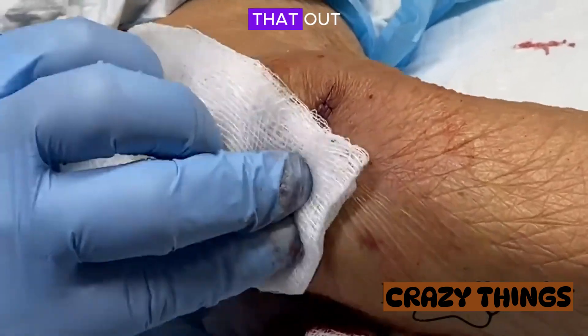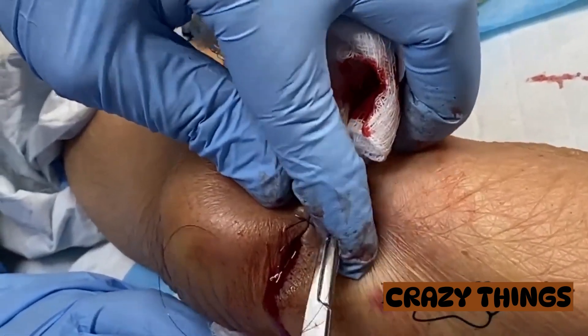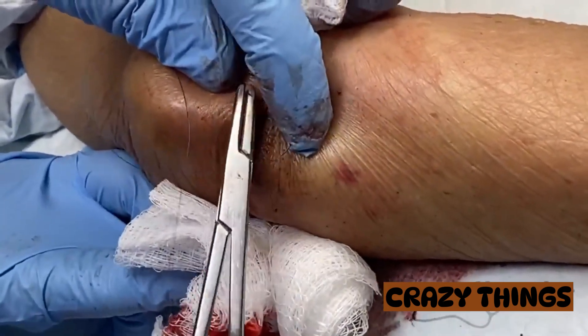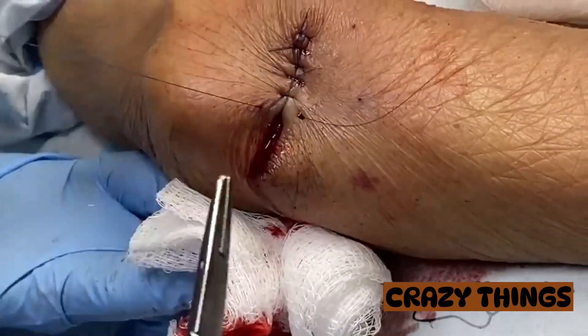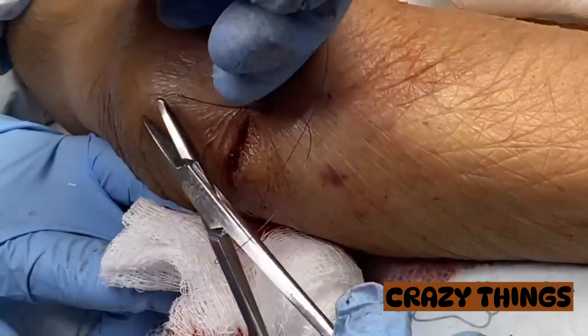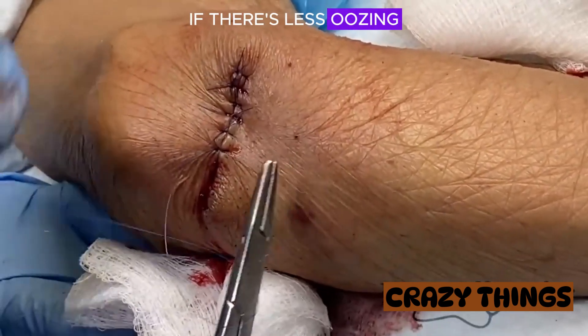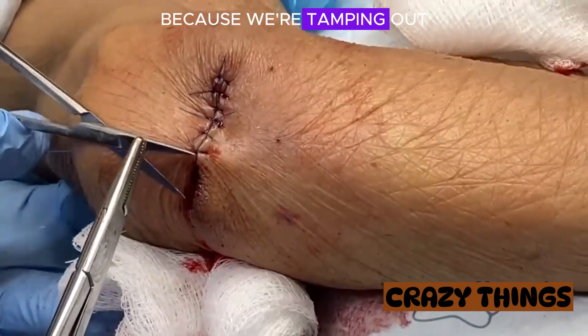So I'm just cleaning that out. We should be seeing that as I progress along with this, there's less oozing coming out of the bottom because we're tamponading these vessels.